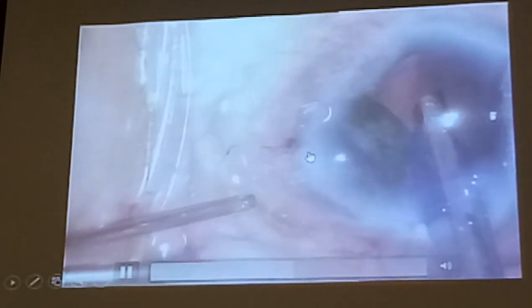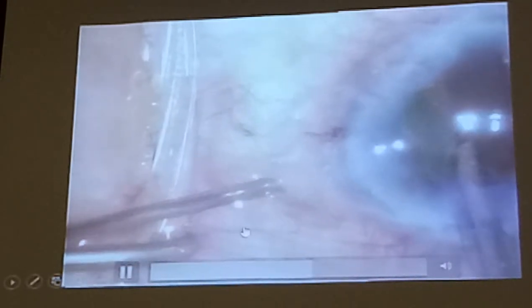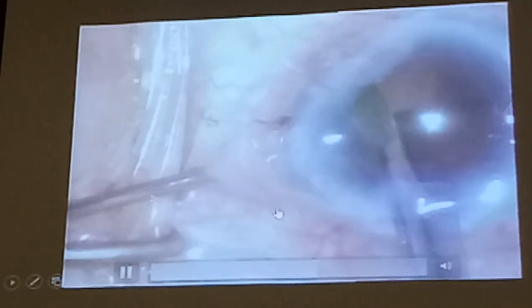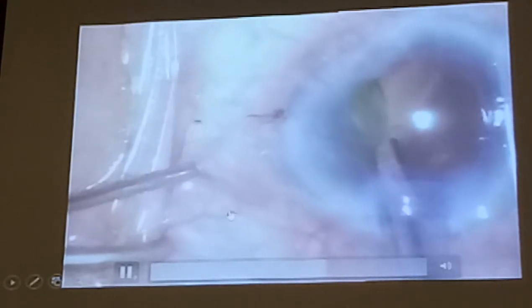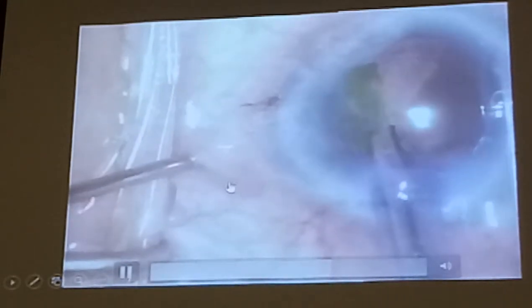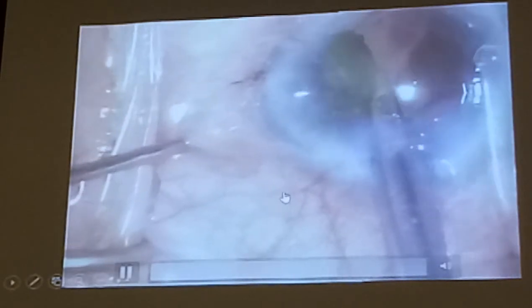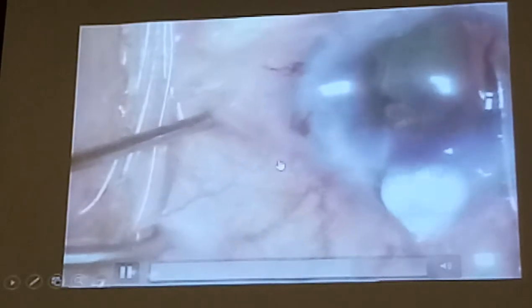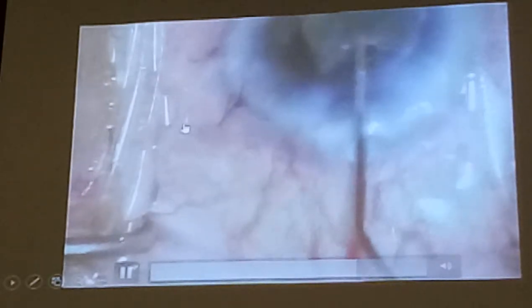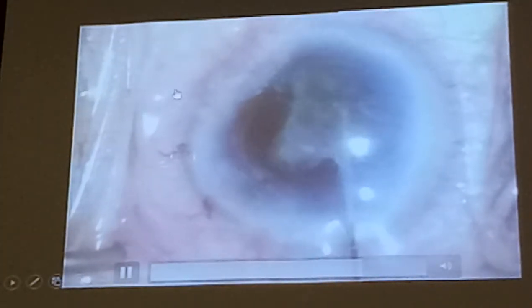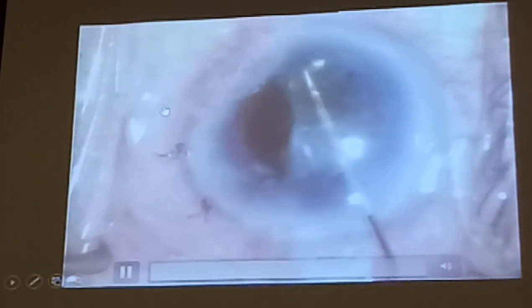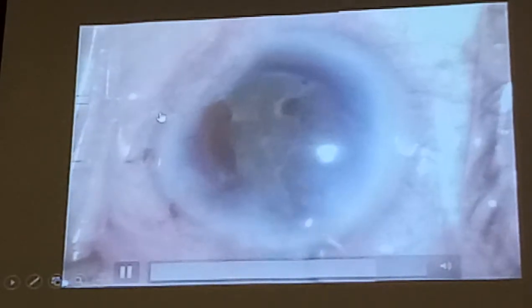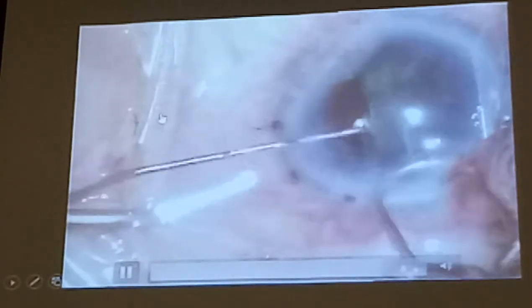Of course it starts to disappear and the surgeon says, 'I want it, I want it' — but you can't because there's vitreous in between. So we take another needle there. I was called to help. We try and levitate — you can load it on viscoelastic so that you can float it up to the iris plane. You can see it being ejected. And once that's levitated, you then remove it by whatever means necessary. That's what you can do with a dropped fragment.